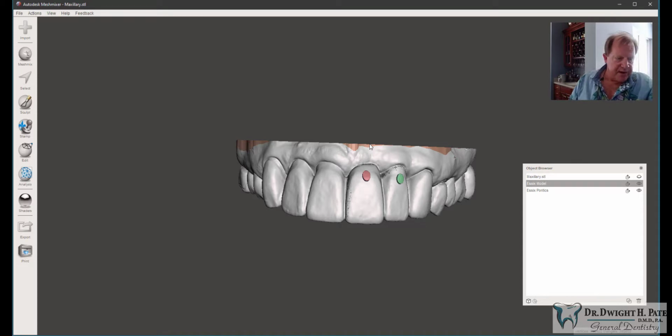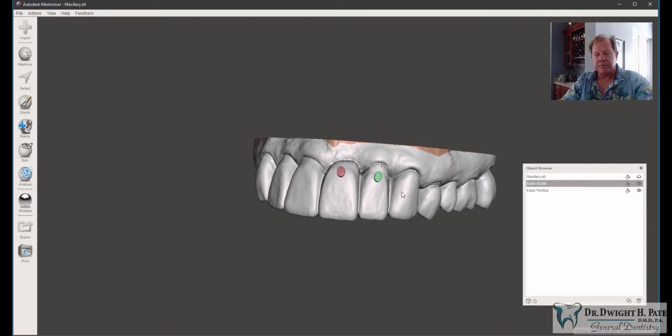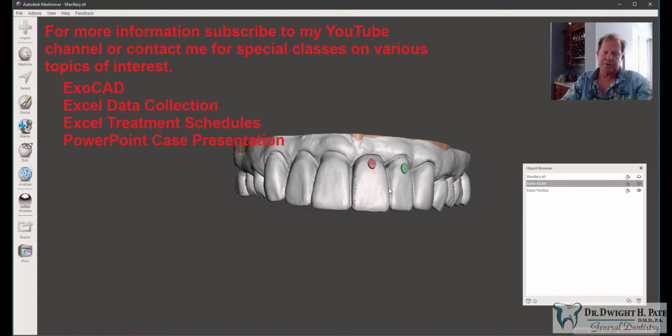The patient never has to be without a provisional restoration. As we know, they tend to wear through these things frequently. This way, it's really not an inconvenience for anyone. When they call the office, they can give us a day or two. The assistant can have these things made, and then the patient can stop by at their convenience and pick them up. So this has turned out to be just a real time saver, convenience factor for both myself and the patients.